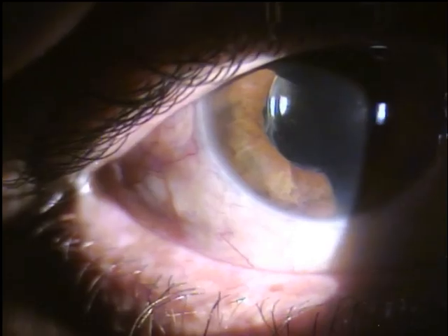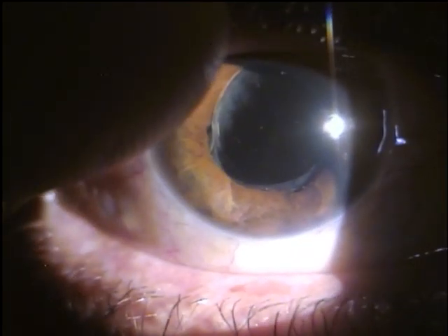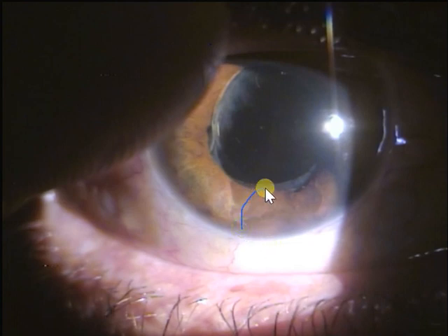It's very important to find that out, and that tells you the patient has got an 80% fill of the silicone oil. And I'll just show you again that area of perfluorocarbon when I get the chance to show you that. This is very important to see. If I just show you over here, this is perfluorocarbon. You have to watch out and look for the area over here. And in between, I'll show in the video that he's got a superior emulsified silicone oil as well. So you've got both things.